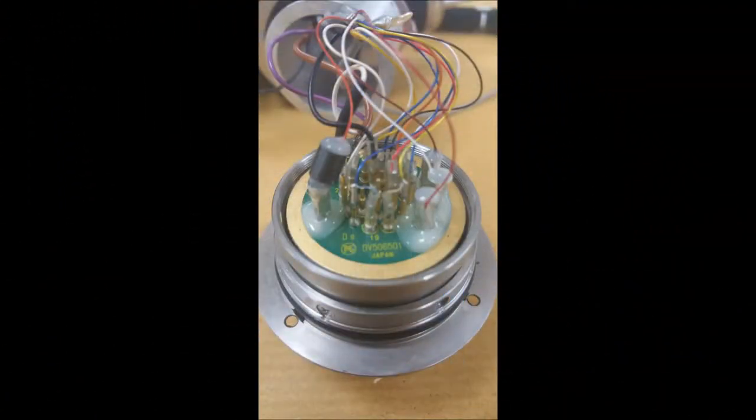Here is the inside of the electrical connector, where the connections take place for your image and button functions. Any fluid in here will damage the endoscope, so it is imperative leaks are found as soon as possible.